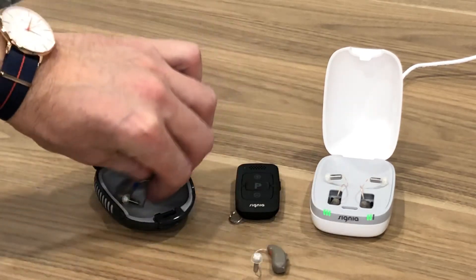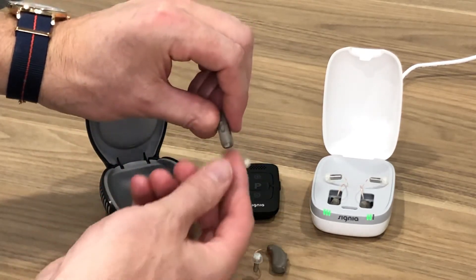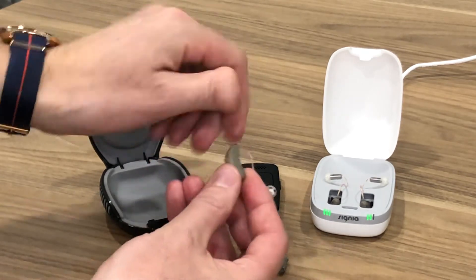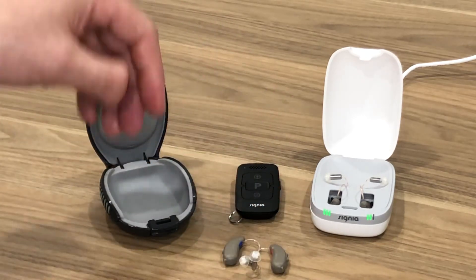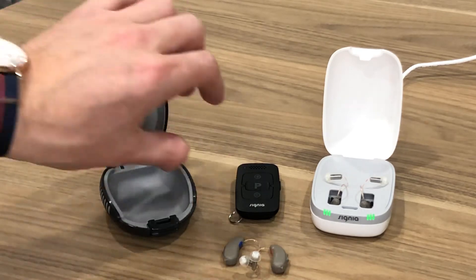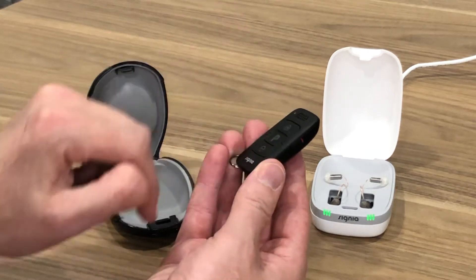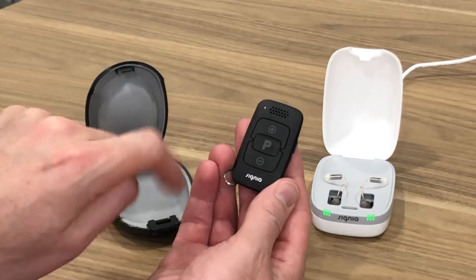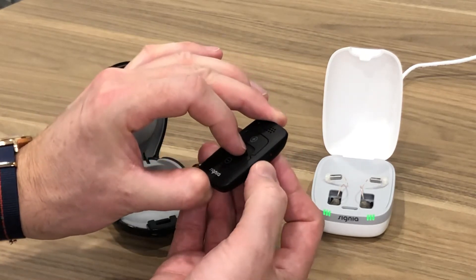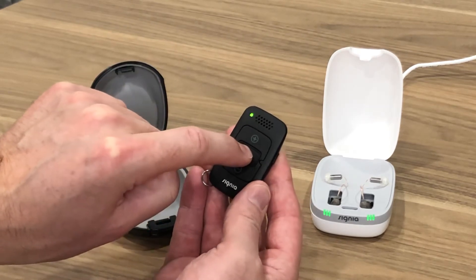Do the same to the other one. If you have two hearing aids you have to make sure you pair your remote to both of them. Turn off the hearing aid by opening the battery compartment, then turn it back on. Hearing aids take about four or five seconds to activate once the battery door is closed, so give it a few seconds. Pick up the remote — it starts in the off position. Put your finger on the program button P, pin it down, then while it's pinned down turn the remote on, and keep your finger pinned down on that program button.